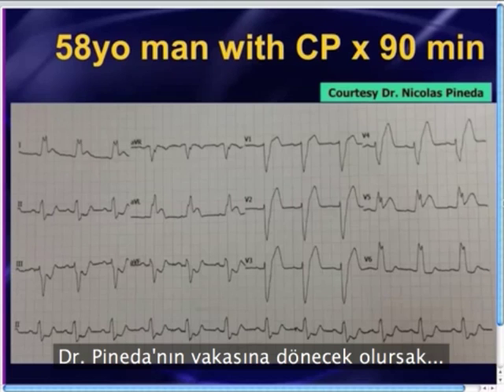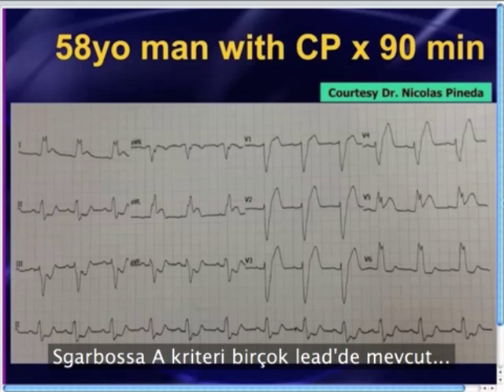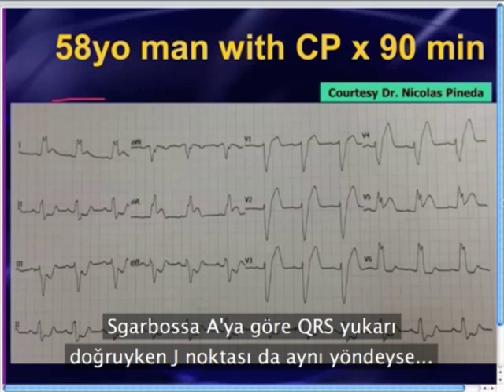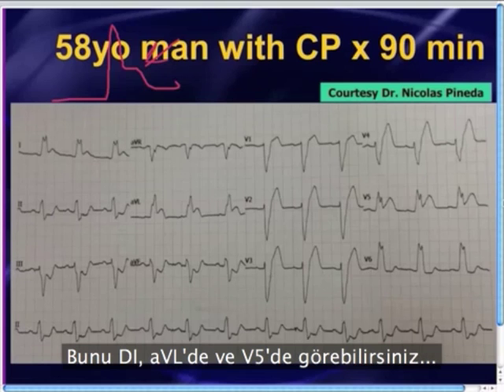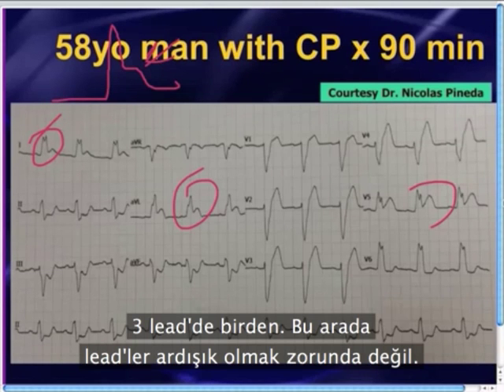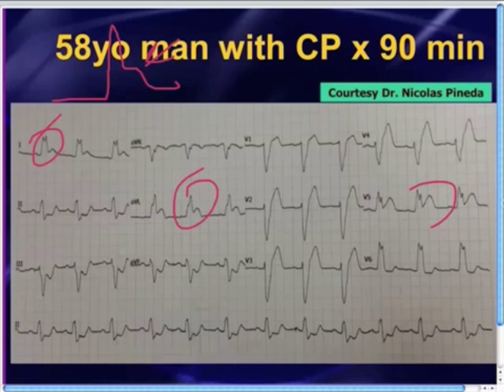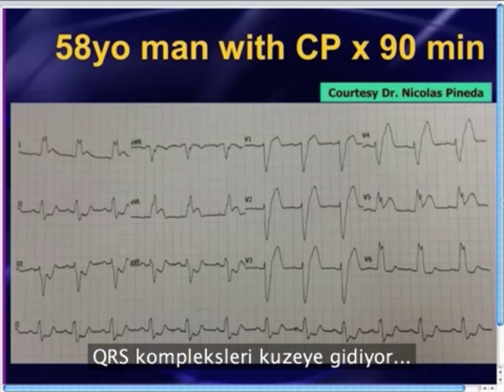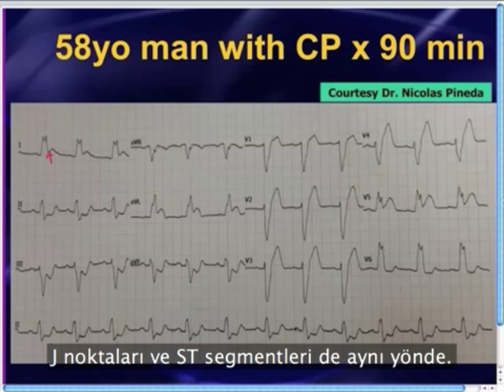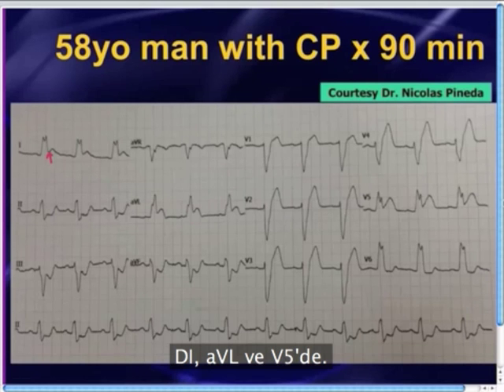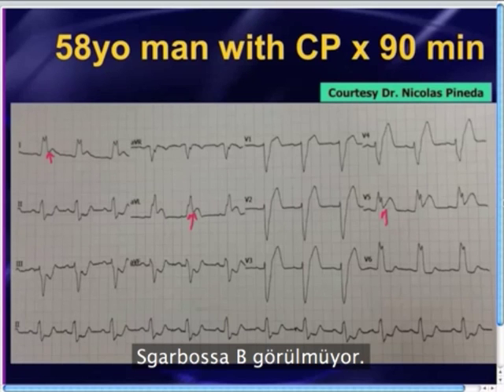Let's go back to Dr. Pineda's case — 58-year-old man with chest pain. Sgarbossa criteria A is present in a handful of leads. Recall that criteria A says if the QRS goes up and the J point and ST are in the same direction. You see this in lead 1, in lead AVL, and in lead V5 — three leads. By the way, they do not need to be contiguous; this works even if you see it in one isolated lead. QRS complexes are going north and the J point and ST segment are concordant in lead 1, AVL, and V5. This person is having an MI.